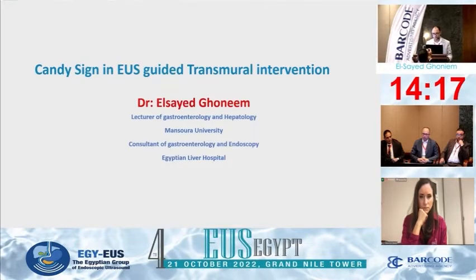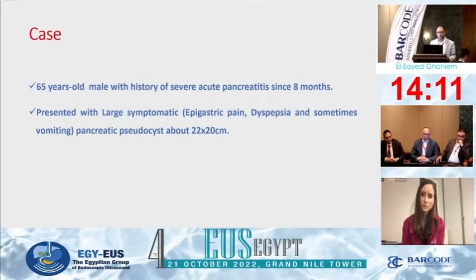Some recommendation we need to do before doing any EUS transmural intervention.